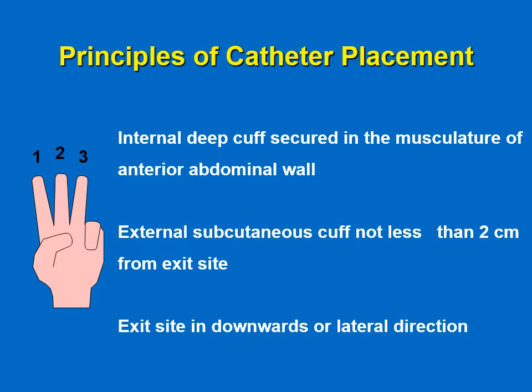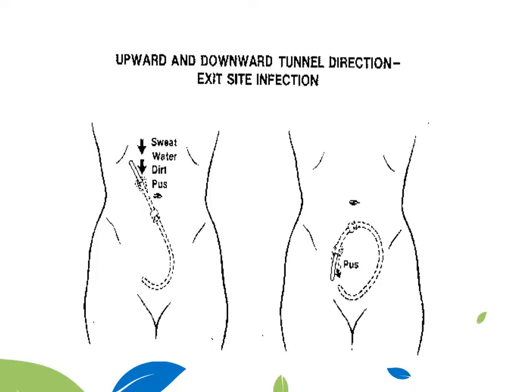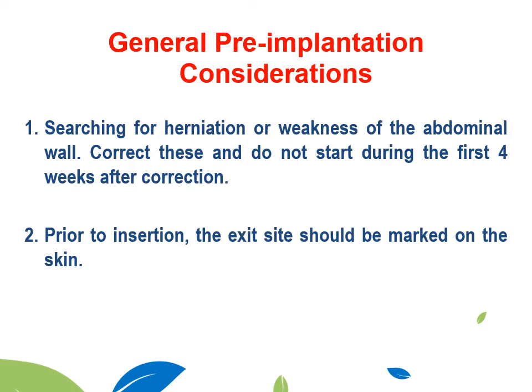We will see this in the next slide, so that it will not allow cuff extrusion easily, and the exit site should always be facing downward or at least laterally, like we see here. If the exit site is facing down, all pus, dirt, sweat, and water will come down by gravity. It will not be collected onto the exit site, as we can see here. If the exit site is facing upward, all these factors would accumulate and will lead to exit site infection, and we will face a lot of problems.